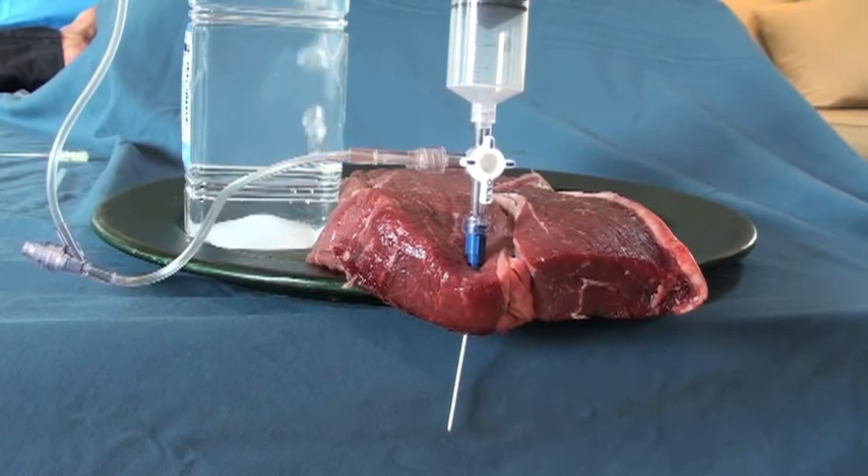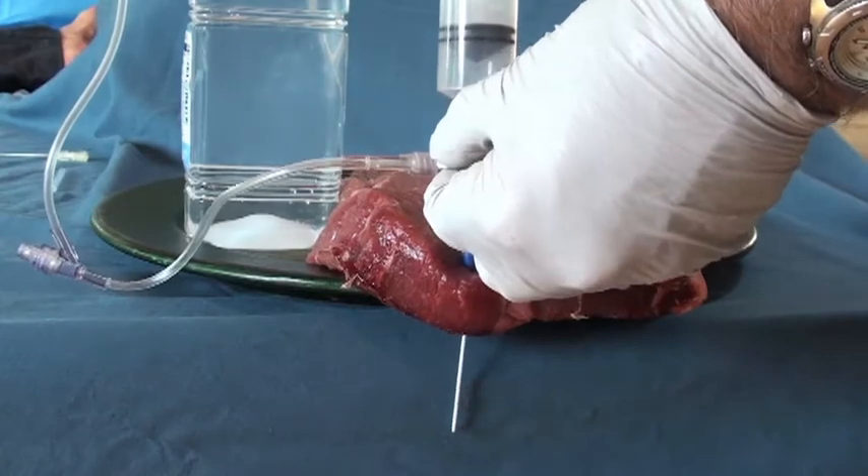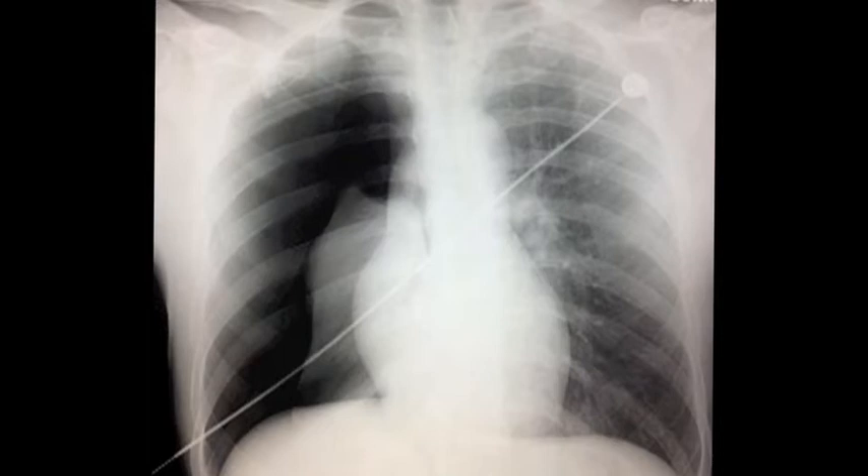He had a massive air leak, so of course I wasn't going to be able to inflate the lung entirely, but that tension pneumothorax was gone. Here's his repeat x-ray. You can see that the lung has come up a little bit, and most importantly, that right heart border is back, and the mediastinum has shifted back to the right where it belongs.